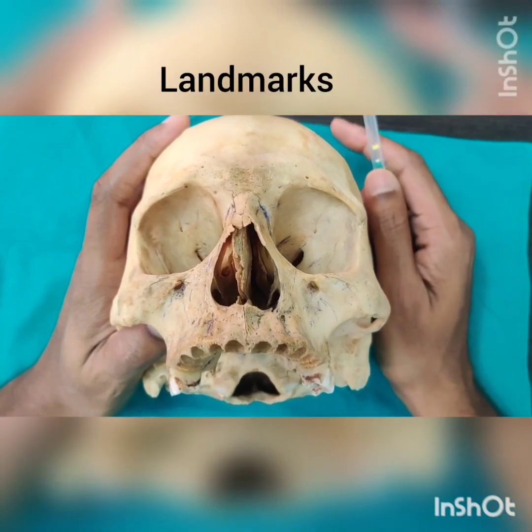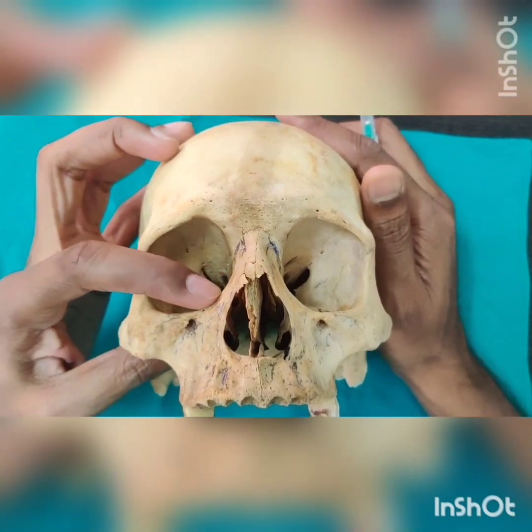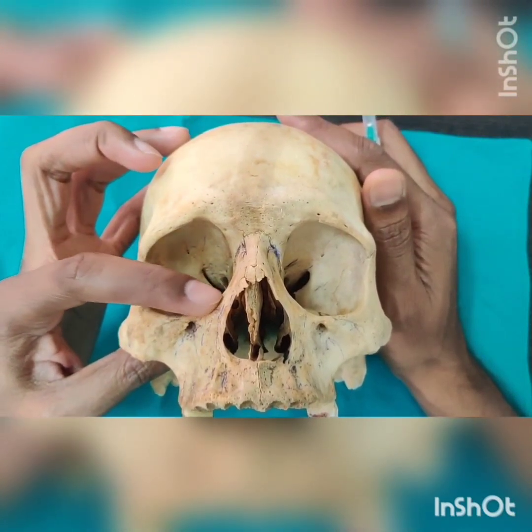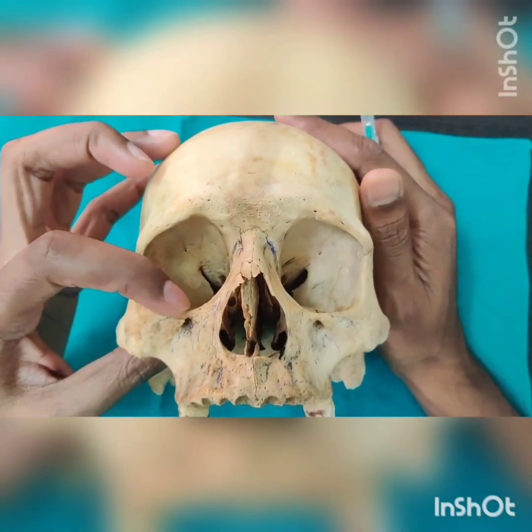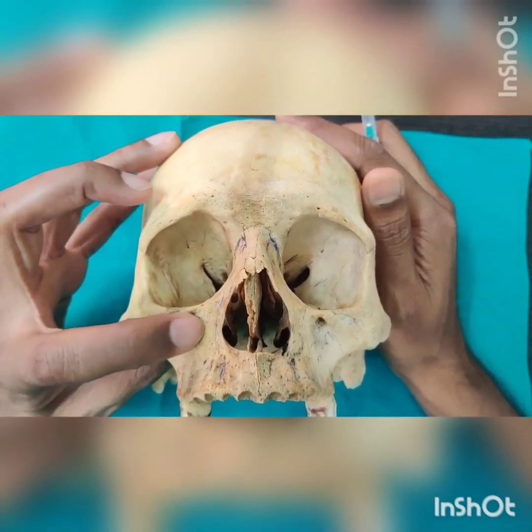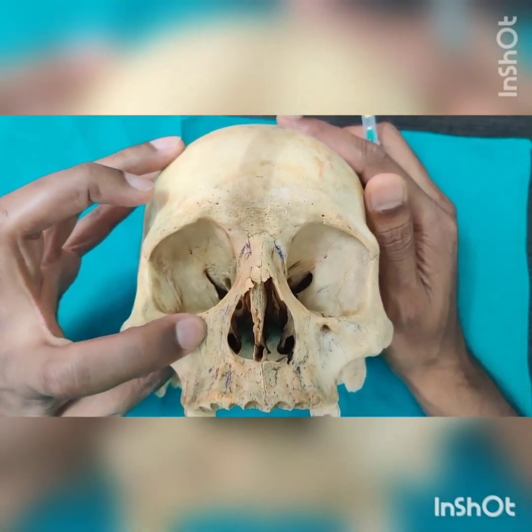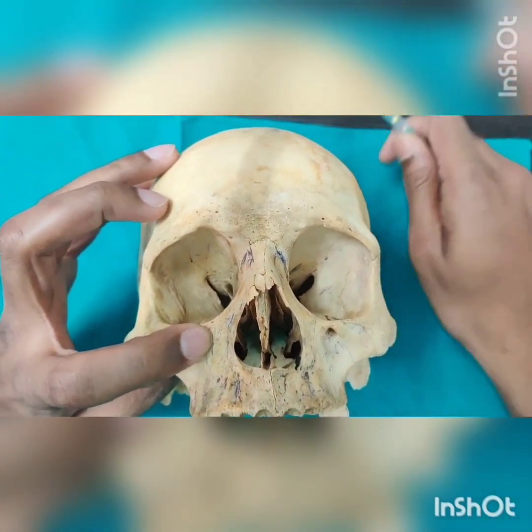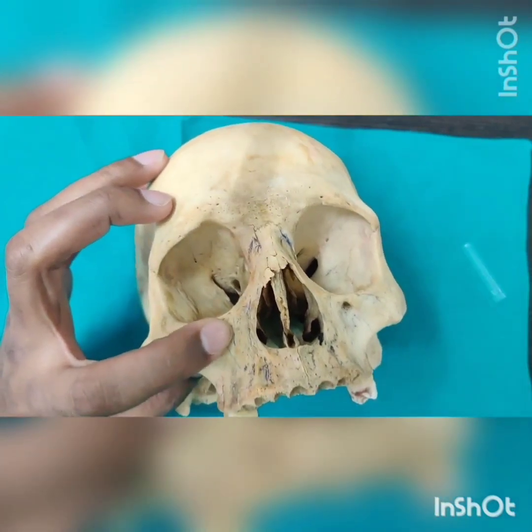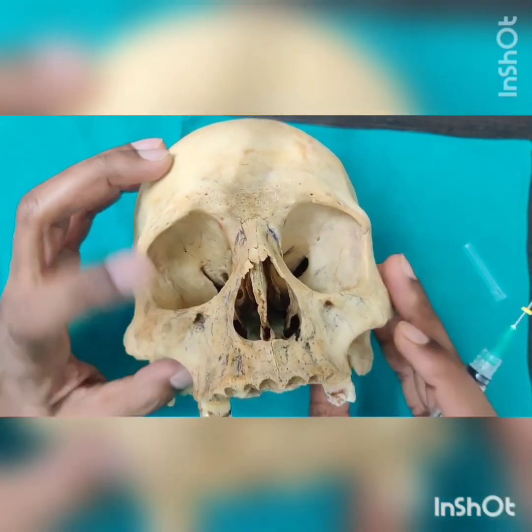The landmark for the infraorbital nerve block is the infraorbital rim. When you palpate here, you get a small notch. Move down and you get a depression, that's the infraorbital foramen. The approach is basically from the premolar area, known as the bicuspid technique.